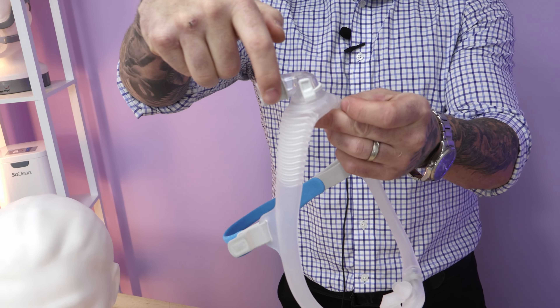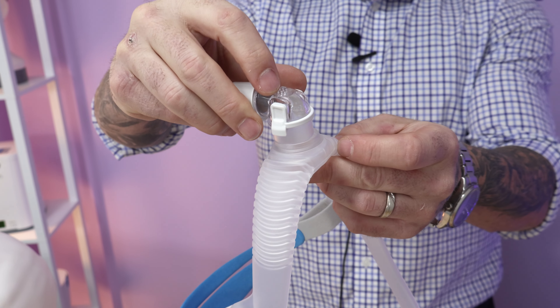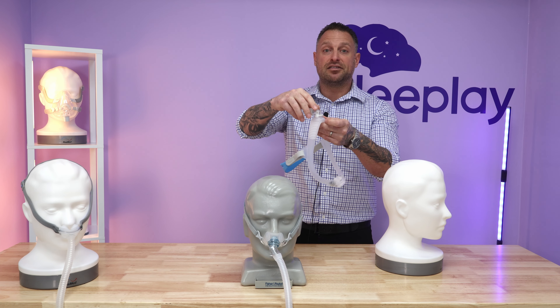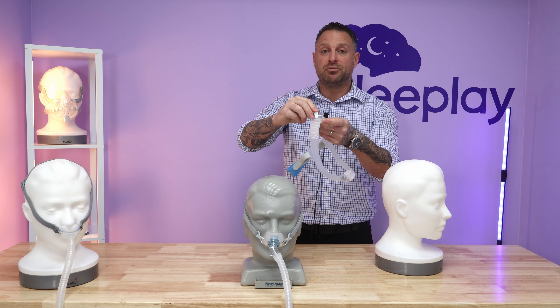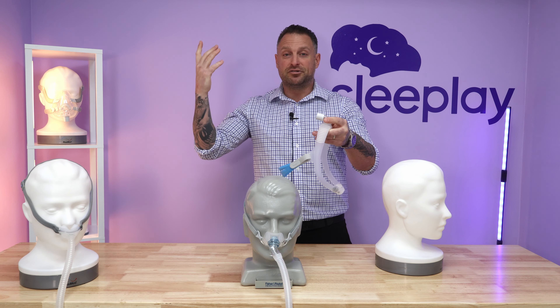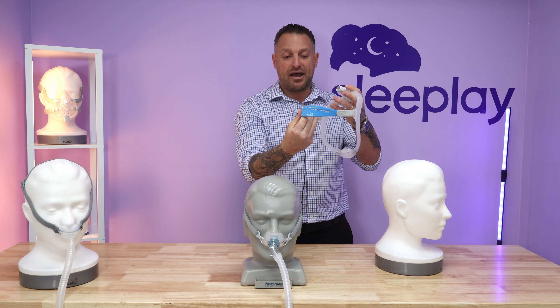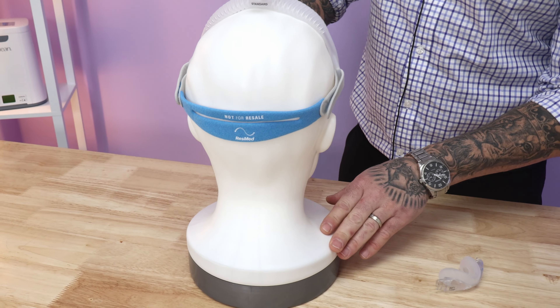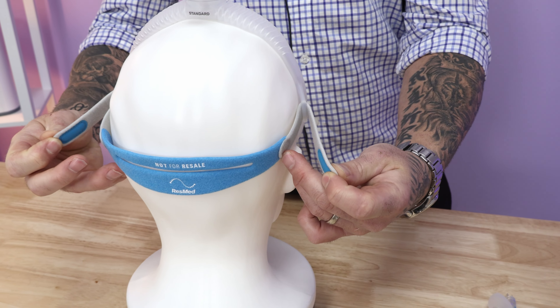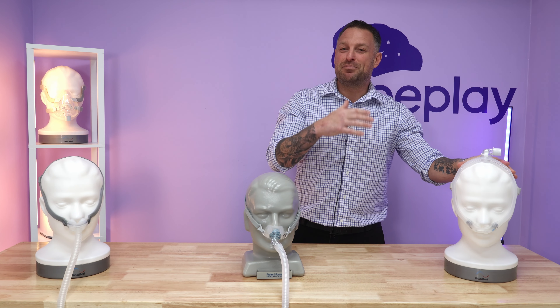You don't have to worry about tubing over your shoulders or your body. When you take this off, just like the N30i, you just squeeze up here and pop it off. If you want to do it James style, you just bend the tubing and do what you got to do at night, then come back and connect it again. This has an extra strap in the back — blue and gray, signature ResMed colors — with little Velcro here that you can tighten or loosen to meet your needs. Once again, the ResMed P30i.